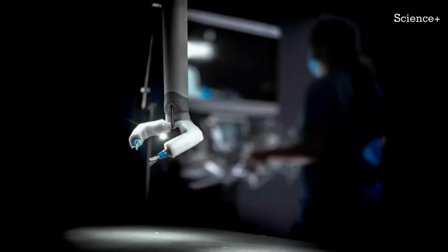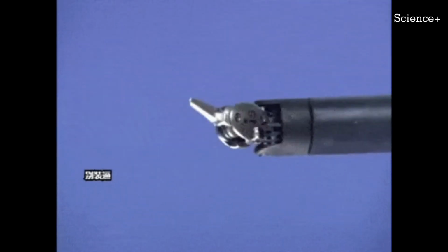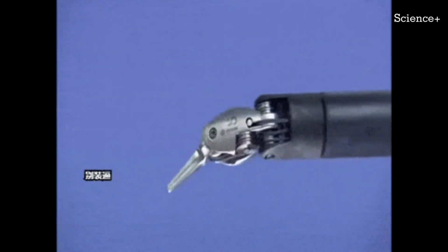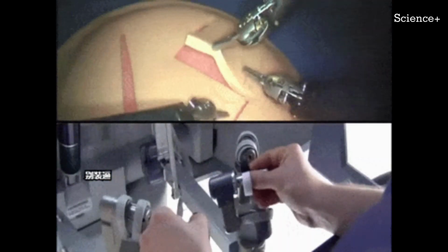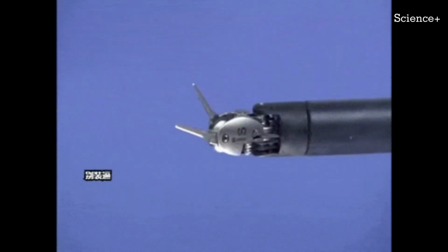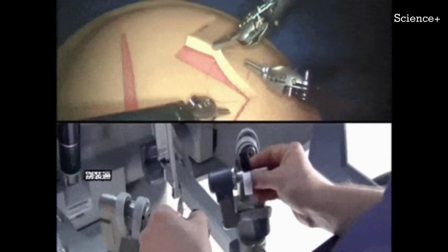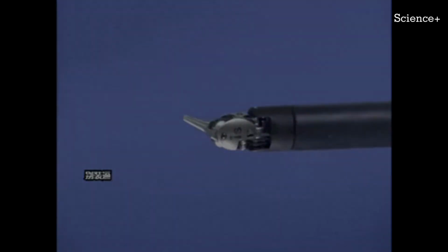journey. Already, according to a press release on the robotic surgeon, Myra has helped with important procedures. Doctors have successfully used the instrument to perform minimally invasive colon resections, for instance, which involve removing part or all of a patient's colon. If Myra works well in space, a surgeon aboard the ISS could take advantage of the tech to help astronauts in need of medical assistance, without posing major risks to their bodies. Myra could be especially important given the lack of personnel, time, and tools on spacecraft.